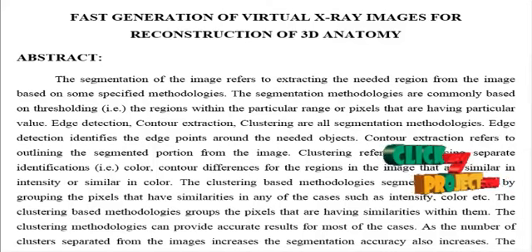Discrete wavelet transformations were applied to the images in order to make the clustering process robust to noises. The required regions are segmented from the pre-processed portions using the FCM algorithm. Each pixel in the images is checked whether it satisfies the rules generated using fuzzy logic. If the rules are satisfied, the values are taken as similar groups. The number of rules generated is default and varies for different images. Each time the rule generation strategy changes in the FCM segmentation, the inverse transformation is applied to the input images and the clusters are obtained based on the generated rules. The image is segmented and the needed portions are identified.